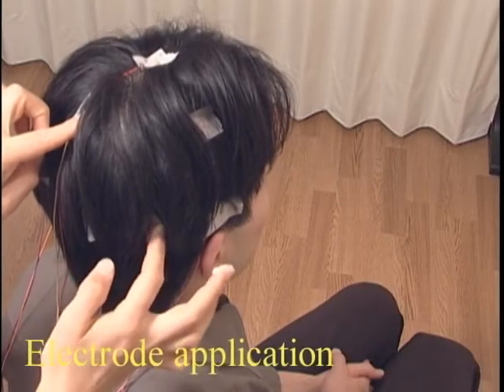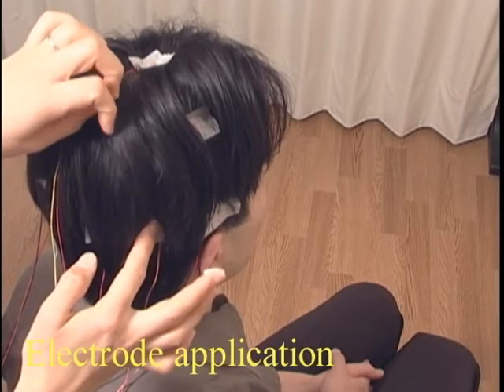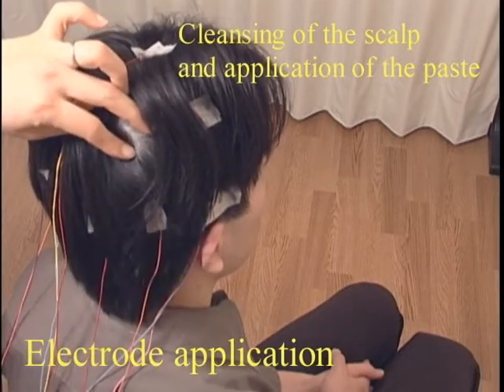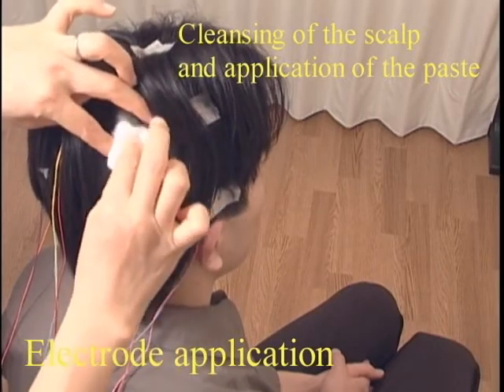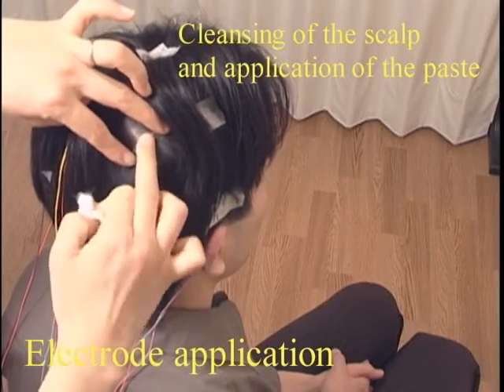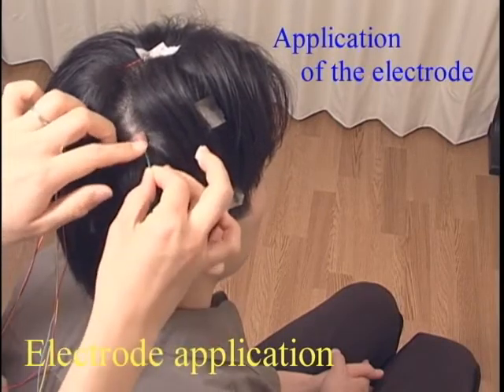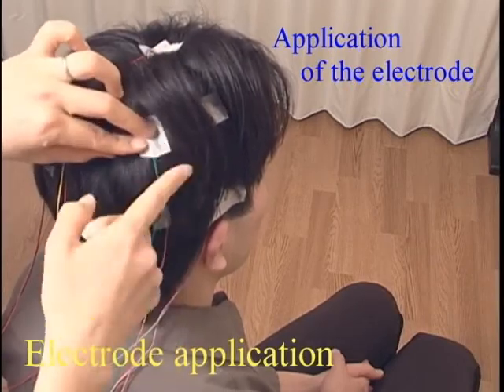First, the method of electrode application will be explained. After deciding the location of the electrode, separate the hair at this point and press down the hair with 2 fingers to expose the scalp. Then cleanse the scalp with an abrasive to remove any oil and keratin. Apply the paste by pressing through the hair without overspreading the paste. Rub the paste on the surface of the electrode. Apply the electrode to the scalp and secure it with the surgical tape.